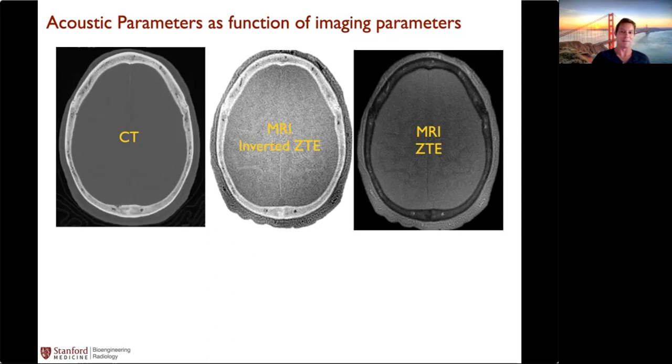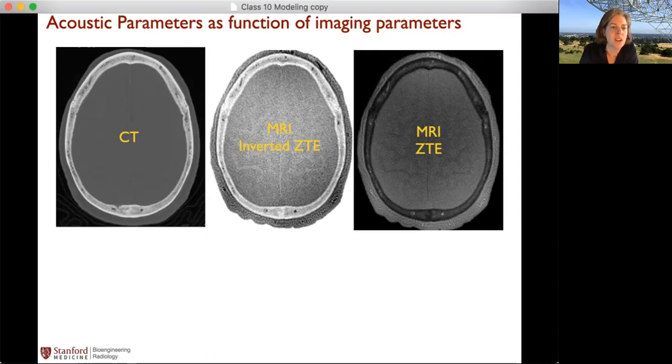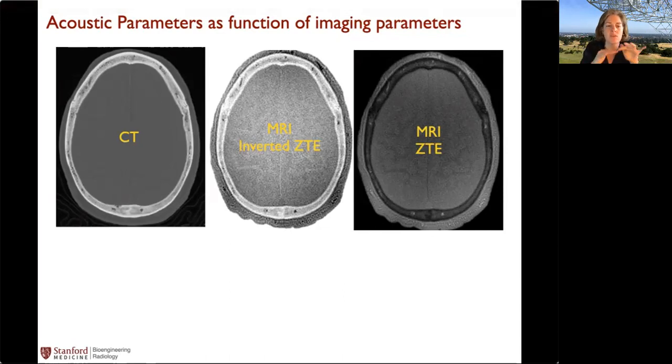Yeah, so there's going to be three roles for the MRI. The first one is for the bone, when we're good enough. The second one is for targeting. That's what Keith was saying: the MRI gives us all that soft tissue contrast in the brain to target the neural structures that you don't see on the CT. On the CT, you can maybe window in and see where the sulci are, to see the CSF versus the gray matter and white matter, but you're not going to be able to see the details of the neural structures that you can see with an MRI. And then lastly, it would be an fMRI type readout.